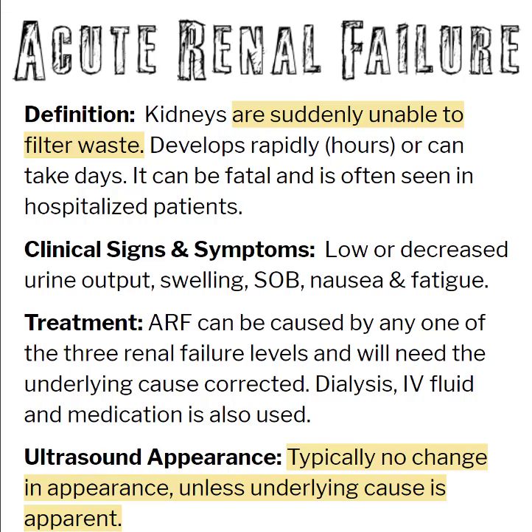Now, the tricky part with acute renal failure is that there typically is no change in appearance to the kidney. I don't know how many times I have scanned an acute renal failure patient and everything looks absolutely normal. But if you think about it, there are so many causes that we can't see by ultrasound, like congestive heart failure and hypotension, that we're not going to see the cause on ultrasound. However, if there was a cyst causing a blockage, or a large mass causing issues, then we're going to see those, and then we can help the doctors get in the right direction for treating the ARF.